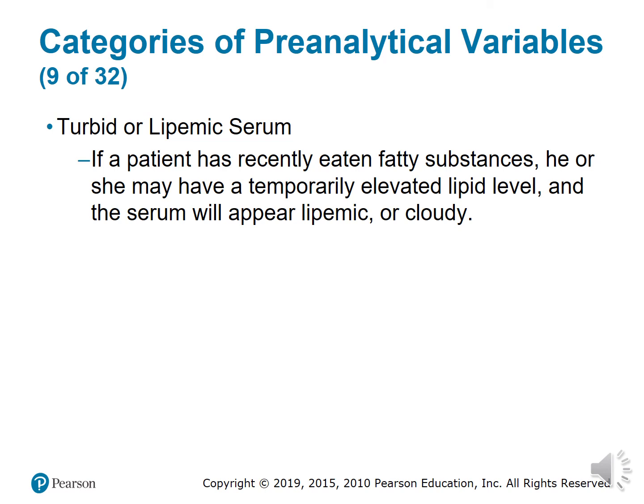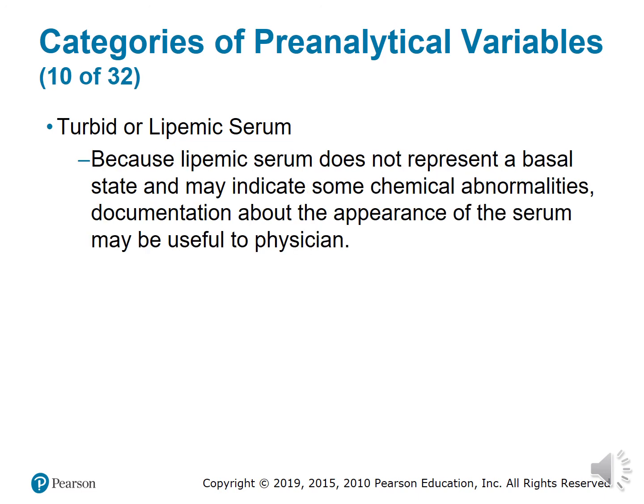For a lipid specimen, if a patient has recently eaten a fatty substance, he or she may have a temporarily elevated lipid level, and the serum will appear to be lipemic, or cloudy. Because lipemic serum does not represent a basal state and may indicate some chemical abnormalities, documentation about the appearance of the serum may be useful to the physician.